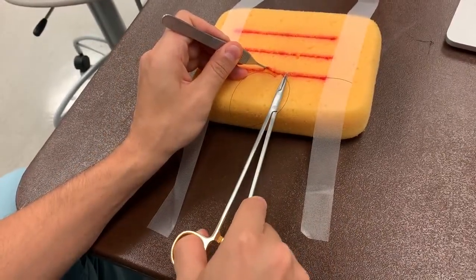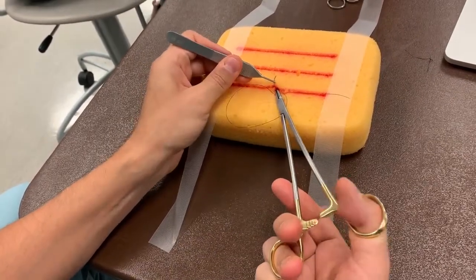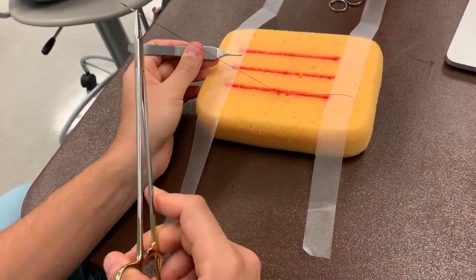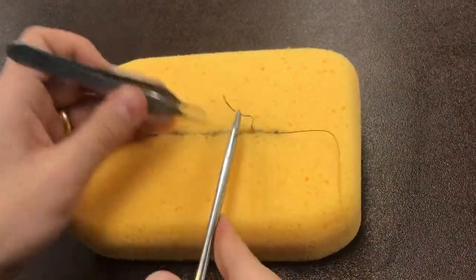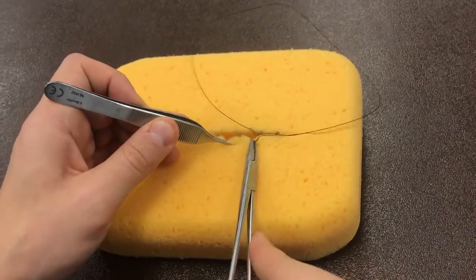For the third throw, look at how far away the left hand is picking up the skin from the needle entrance. You don't want to pick up the skin too close to the needle. Overall, this technique allows you to sew with both hands making small movements and avoids picking up the needle with your fingers, which is an obvious safety issue.